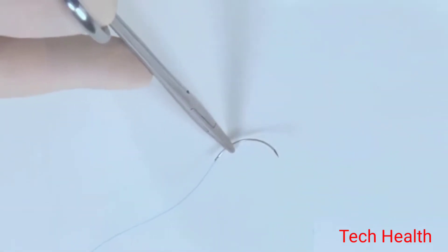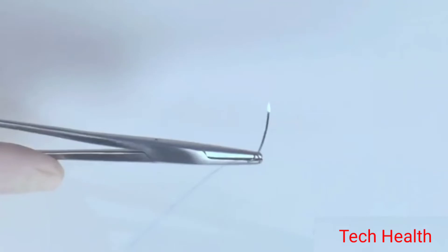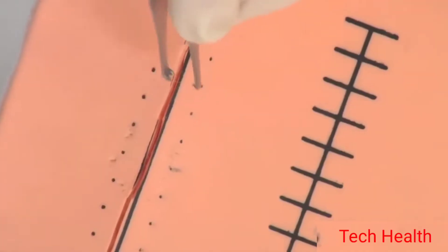Always be aware of the needle location. In general, don't grasp the needle with your hand. Don't poke yourself.